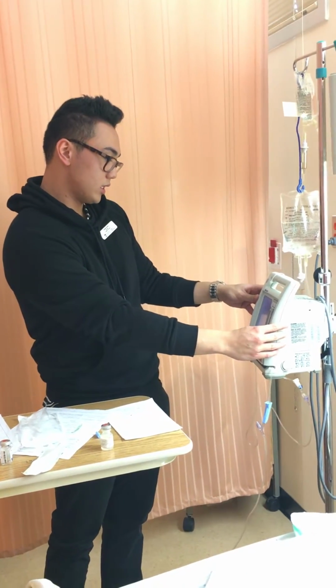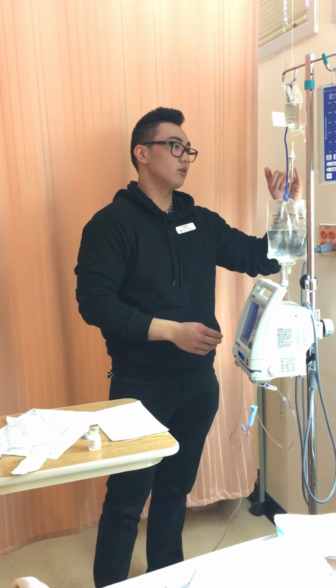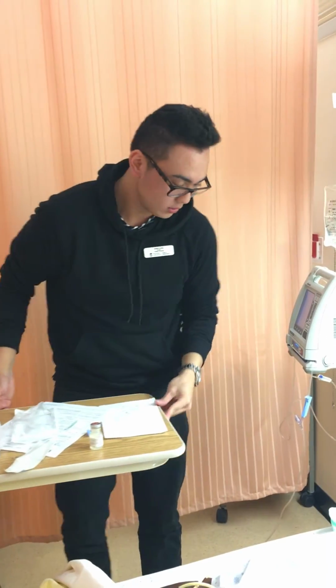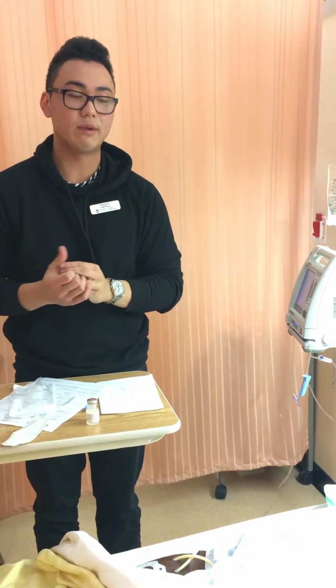And now we will begin our secondary. Open the clamp, and we'll watch for 3 drops here. So we already have 3 drops there. Okay, make sure the line is running. And before we leave, we will let the patient know that we will be coming back in, or we'll stay here for a bit to just make sure that there's no adverse effects right away, and we would just let them know to give us a call with the call bell if they have any issues, and we'll be back in approximately 30 minutes to an hour to see how they're doing. But before we leave, we'd have to make sure that we sign off on our medication. And yes.